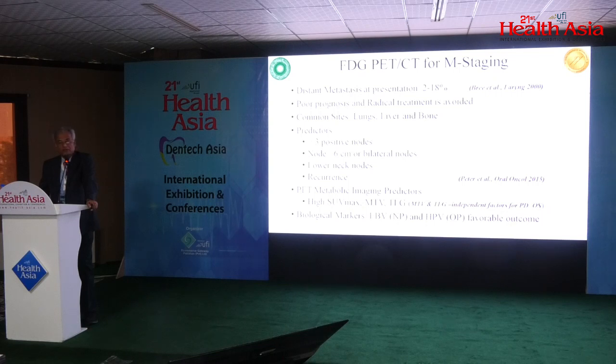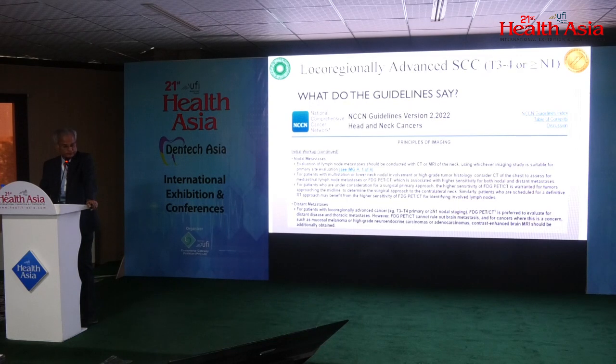PET metabolic imaging predictors of distant metastasis are higher SUV max over the primary tumor as well as the nodes, increased metabolic tumor volume, and total lesion glycolysis. These are the three commonly used metabolic markers, and according to various findings, MTV and total lesion glycolysis are independent predictors for disease progression and overall survival. Certain biological markers are considered to favor a better outcome, like Epstein-Barr virus positive serology and human papillomavirus positive serology, with a favorable outcome in patients with head and neck cancer.